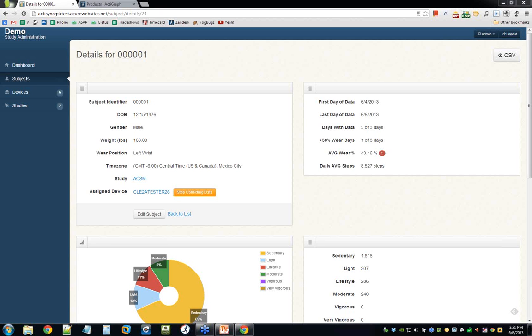Another question from Jameen: the template in ActiLife. Those won't be compatible with this system, but you will eventually have the same measures from ActiLife in this system, and you'll be able to choose those.